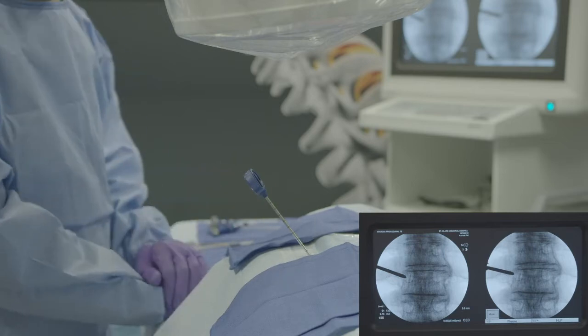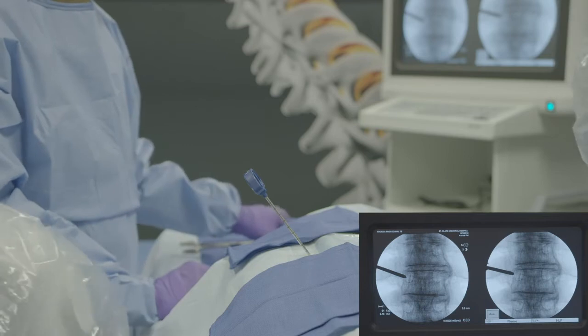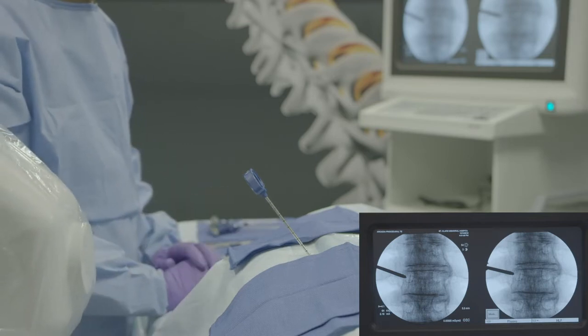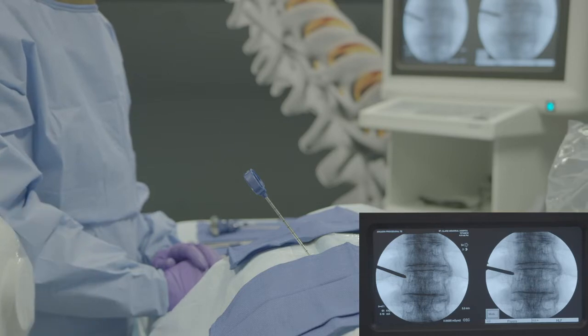In the lateral view, verify that the access introducer is docked on the posterior aspect of the pedicle and is in line to be equal distance from superior and inferior end plates.